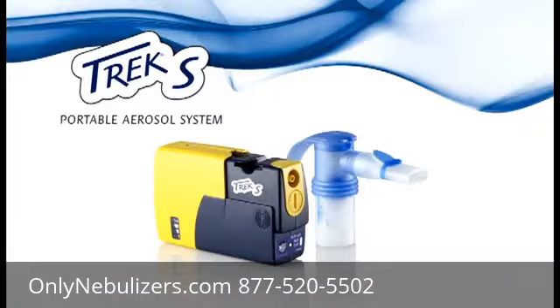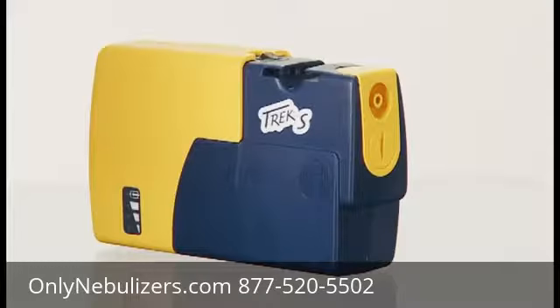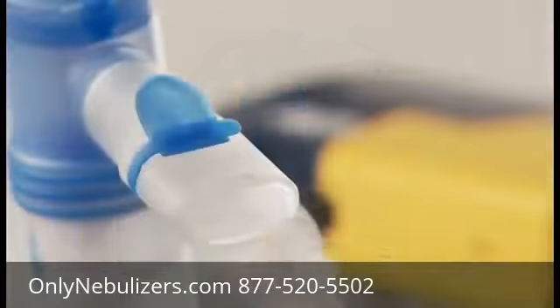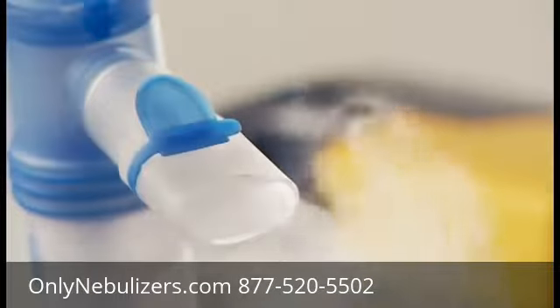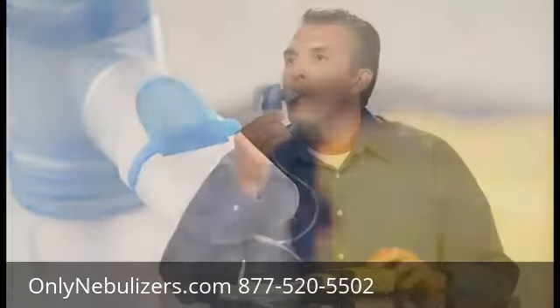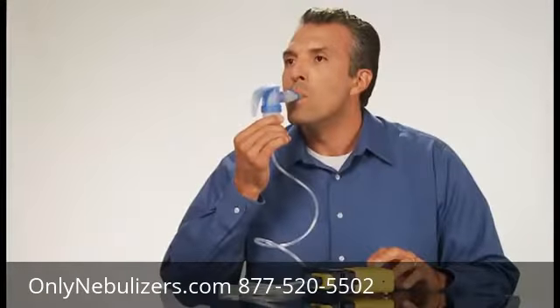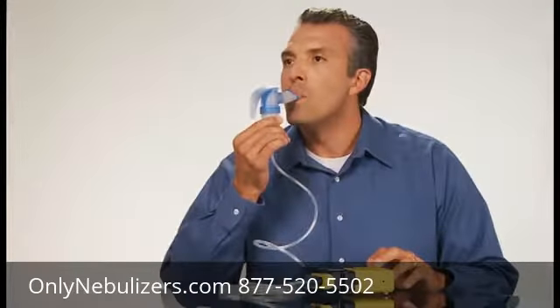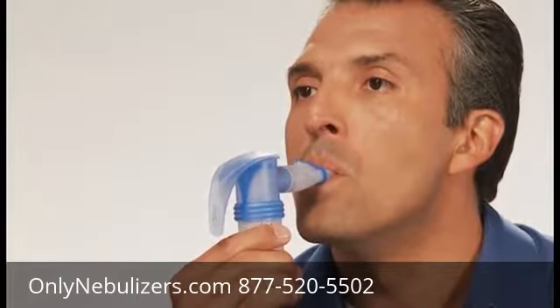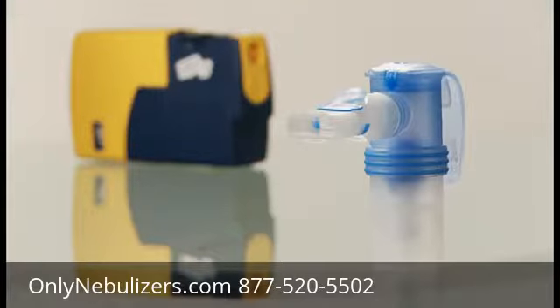Let's introduce you to your new Trek S. The compressor creates pressurized air, which then travels through a tube to the nebulizer cup. The nebulizer cup is the device that turns your liquid medication into a mist or aerosol. Pari's breath-enhanced reusable nebulizer design creates optimal particle size and delivers medication efficiently to the lungs. Be sure to clean and disinfect your nebulizer regularly as instructed by your physician and as indicated in the package instructions.